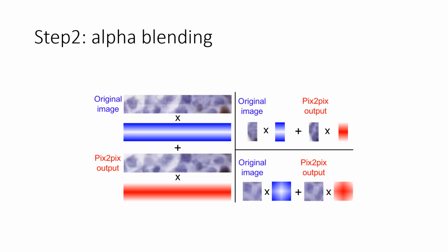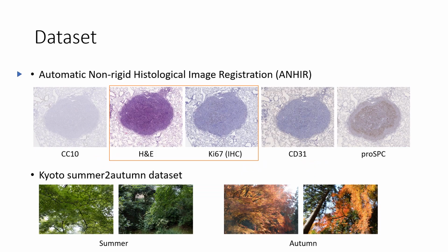Because there may be slight visual discontinuities between the parts that are processed by Pix2Pix and the other unprocessed parts, we propose a post-processing step to remove such discontinuities. In short, we conduct an alpha blending process with a novel spatially varying weight, so that two kinds of images are smoothly blended. We now explain our experiment results.